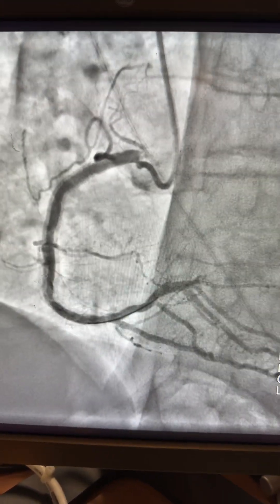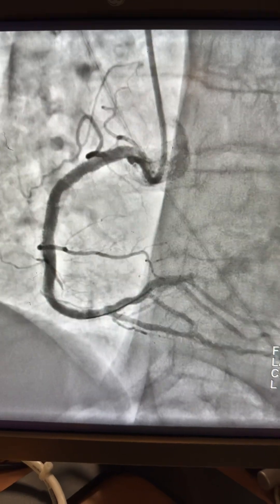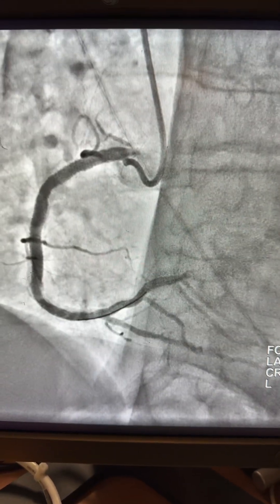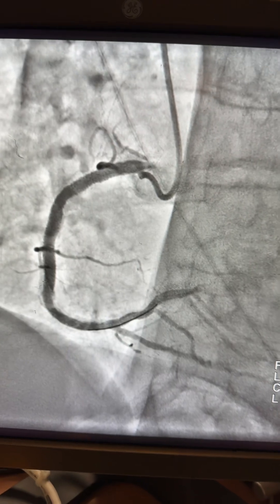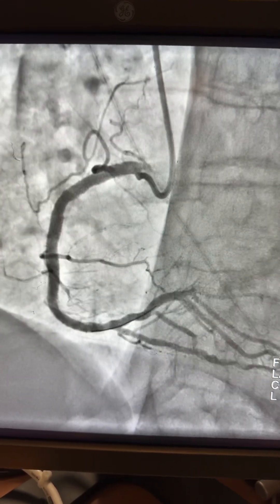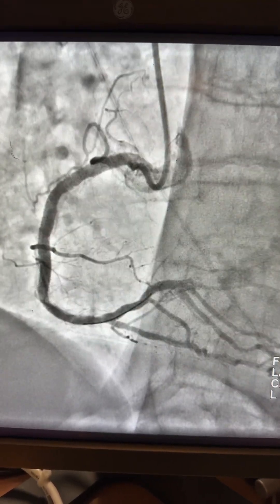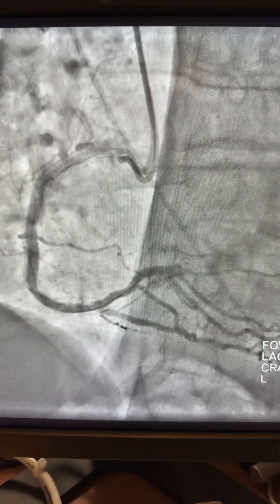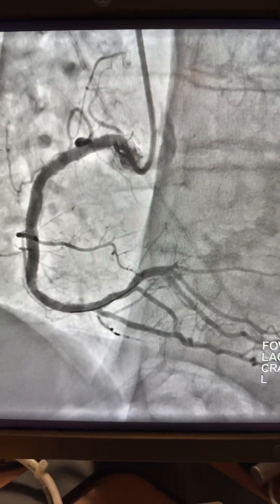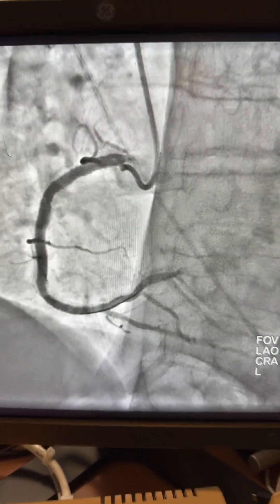Here is the final result — you can see very nice stent expansion in the mid segment and the proximal segment of the RCA. Of course, such results you won't achieve using just NC balloons or regular balloons. I'm very happy and satisfied with this shock wave result. Thank you very much.